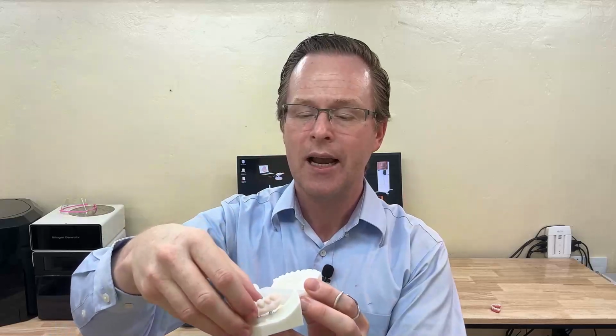You can either use the dentures module within exocad to produce it that way, but if you've invested a lot of time into making this monolithic prosthesis, like case in point, I'm taking a reference denture, I've 3D scanned this patient's denture. I now have fabricated my try-in prosthesis, and the patient's been wearing this try-in for, I don't know, a month, something of that nature.